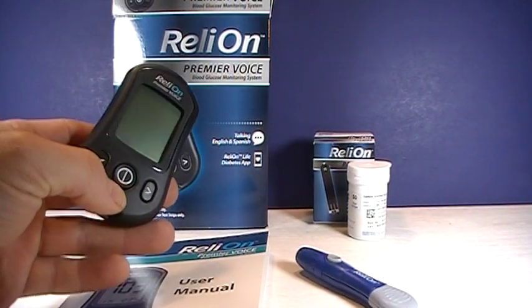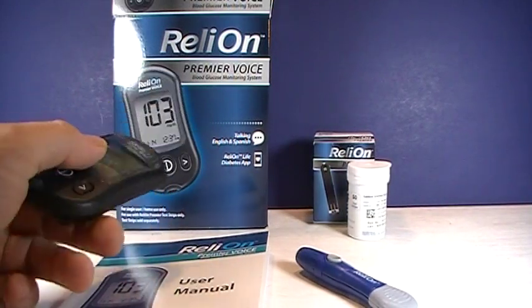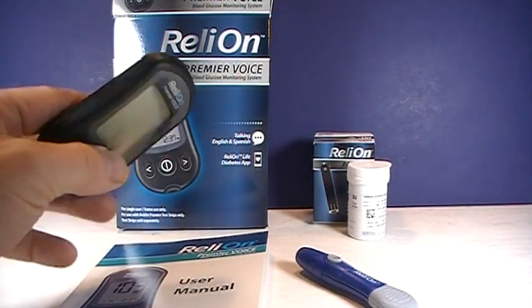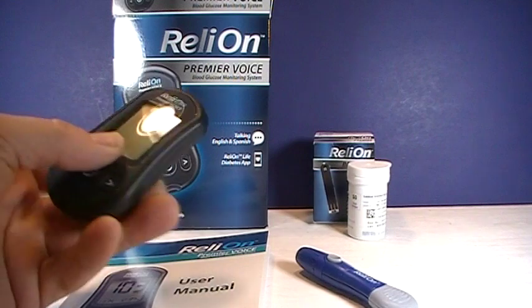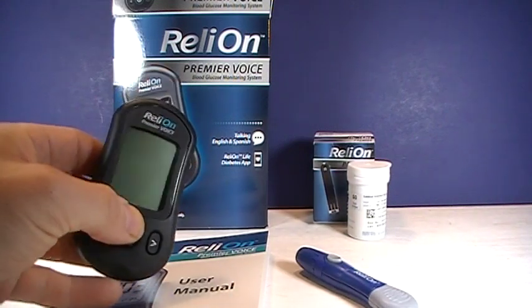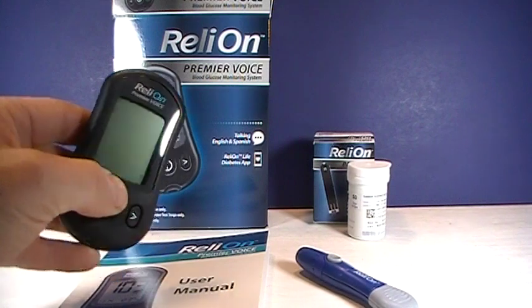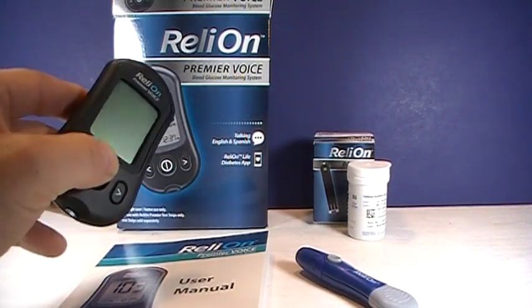Hi, this is Josh. I'm a pharmacist with pharmacisttips.com. I'm going to show you the talking glucose meter. This is actually sold by Walmart. It's their own brand of glucose meter called the Relyon Premier. This specifically is the Relyon Premier Voice.